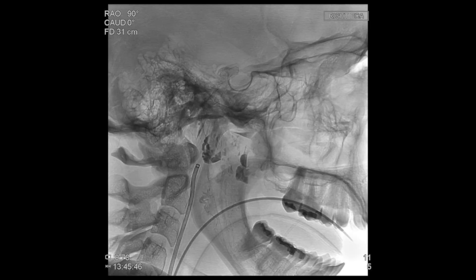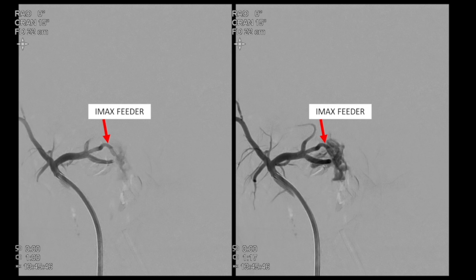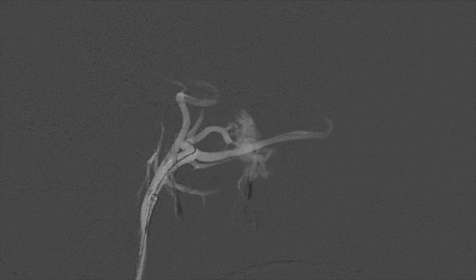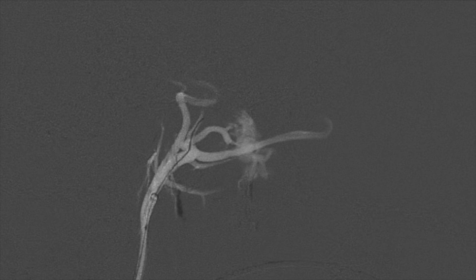On the unsubtracted images, you can see multiple densely calcified phleboliths in the soft tissues of the face on the right. The angioarchitecture of the fistula is better demonstrated here, where we see an internal maxillary artery branch diving directly into the pterygoid venous plexus. We suspected that this would be a single-hole fistula. For navigation, we used the Synchro 2 guide wire to get into the artery we thought was directly supplying the fistula.